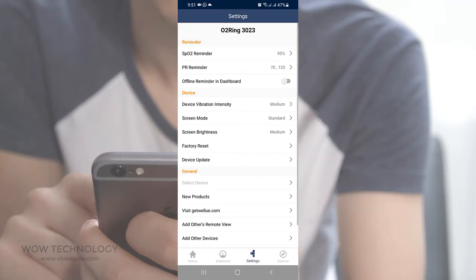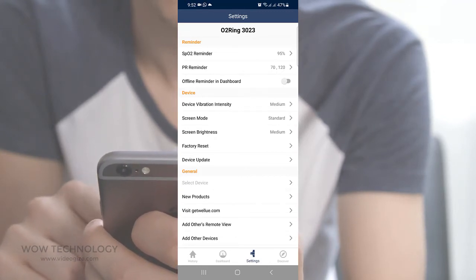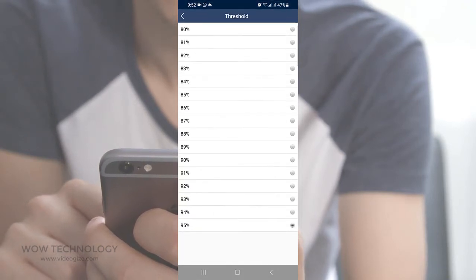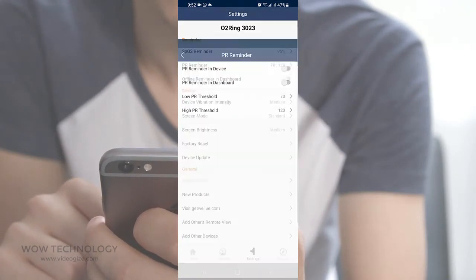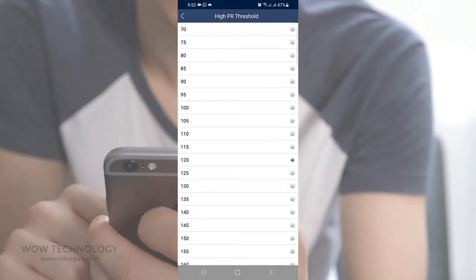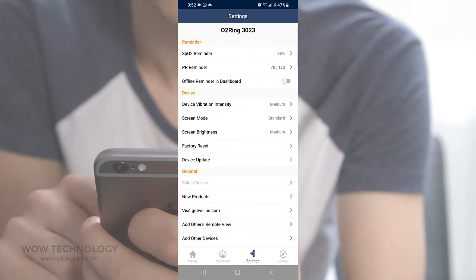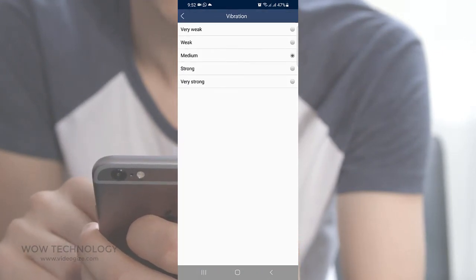From the Settings tab you can adjust your O2 ring settings. First, you can adjust the SpO2 reminder setting and its threshold. You can also set up your PR reminder and adjust the low PR or high PR threshold. You can also adjust your ring vibration intensity from weak to strong.